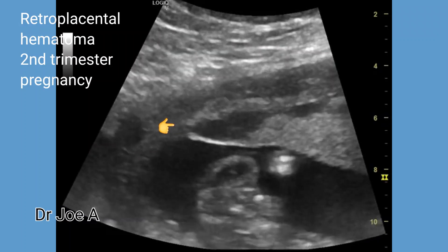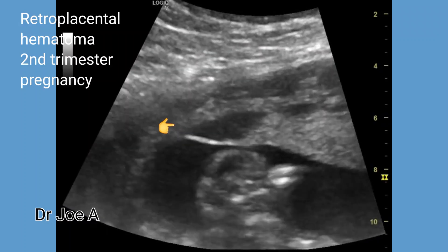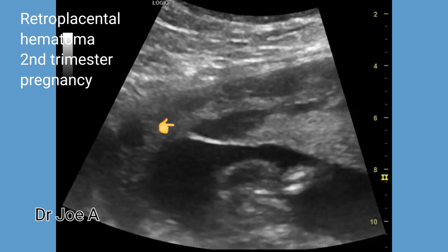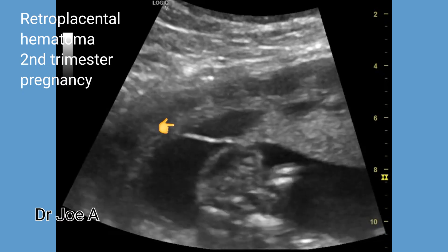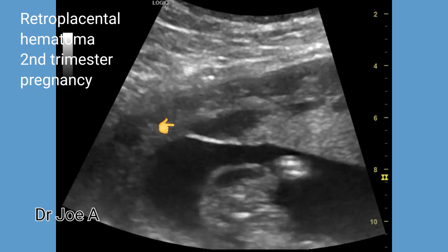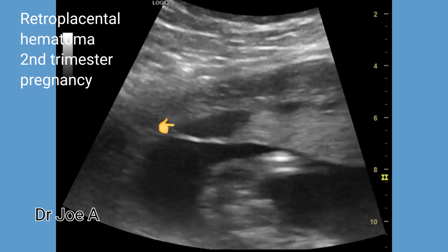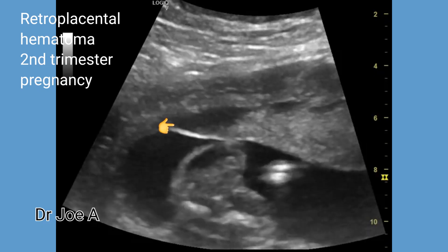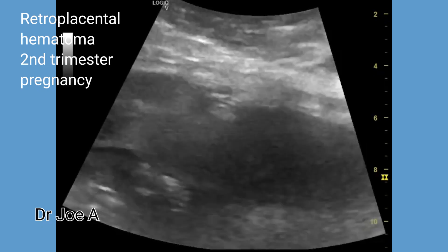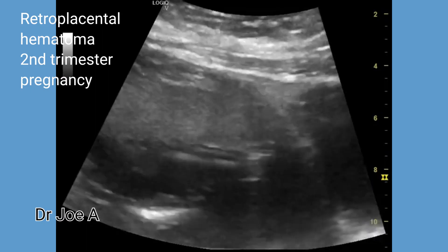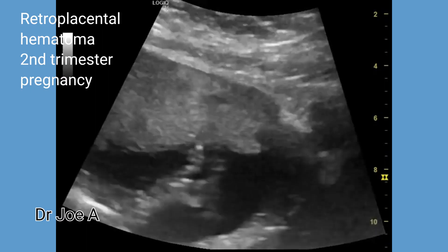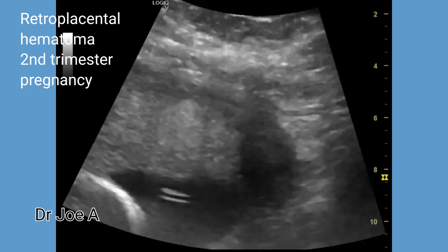This second trimester pregnancy came with a history of pelvic pain and bleeding. The placenta is anterior and the upper border shows a hypoechoic collection. Let's slide the probe downwards to the lower border of the placenta.